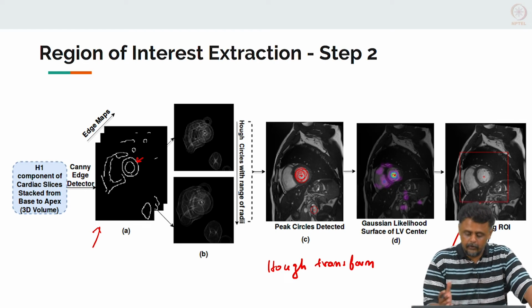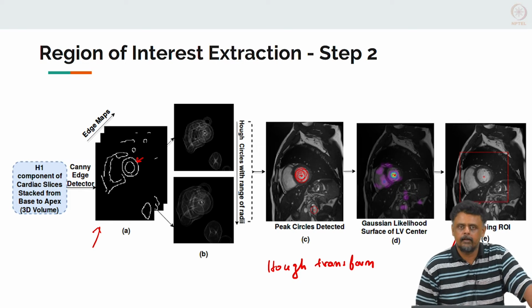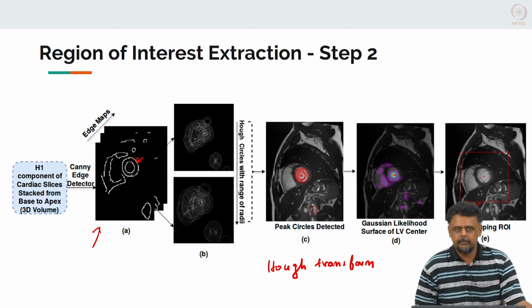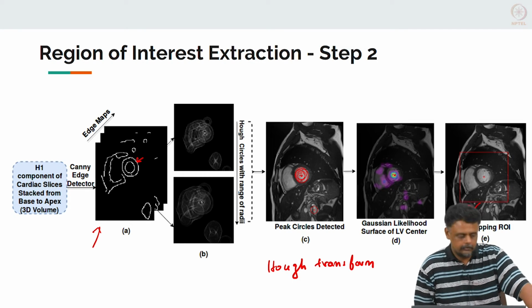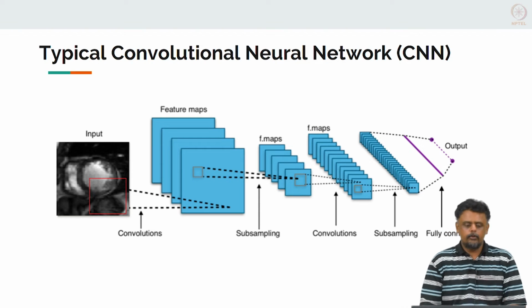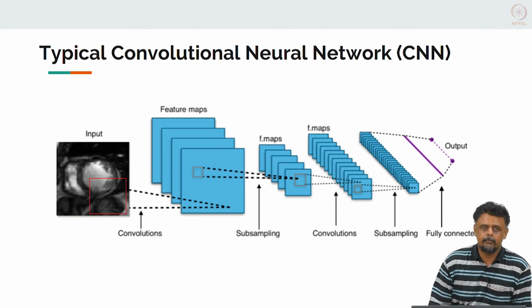Also recall that when we did this, memory issues were also there, but now there are more powerful GPU cards and more memory available in them and RAM available. So, in fact, you can fit very large images and feed them as input to CNNs. Of course, training them is also much harder, you have to figure out the correct hyperparameters for the same. So what are we going to use? We are going to be using a CNN, no surprises there, because it is one of the powerful tools for image processing.